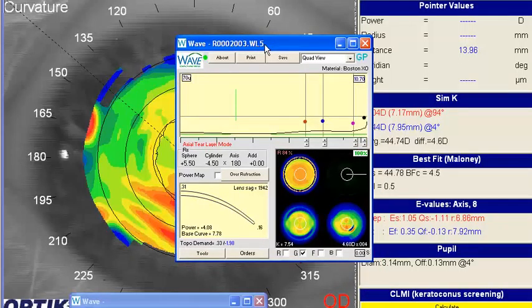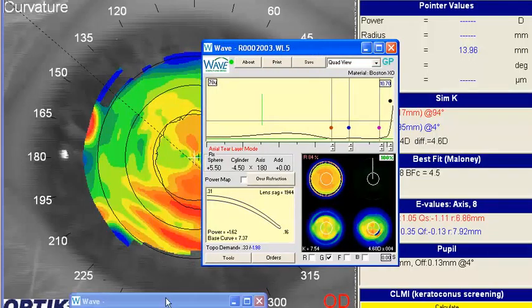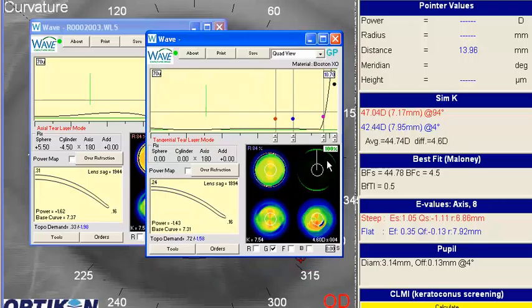And so what I noticed when I looked at your design, and I believe from looking at this, it looks like you may have chosen to average out the astigmatism, and I just set this design back to sort of a default mode in a G-sim just so we can look at these two meridians. And you'll notice the horizontal meridian is about a 778, and you've got about a 795, and if you look at the vertical, you're at a 737. Now I took the same basic lens, but I opened it up without averaging the astigmatism, and if we look at this design now, in the vertical we're at about 731, but the horizontal we jump up to 797, so we get a little closer matching.